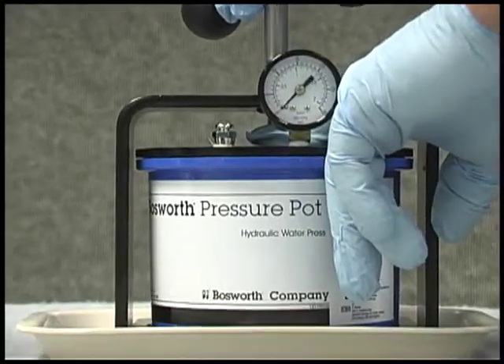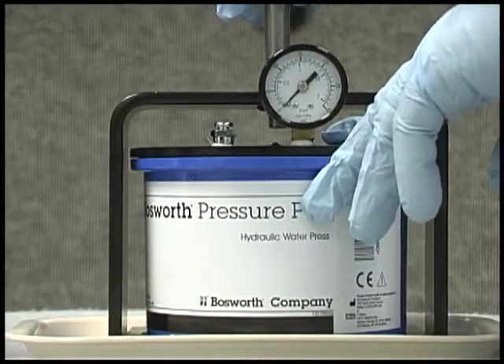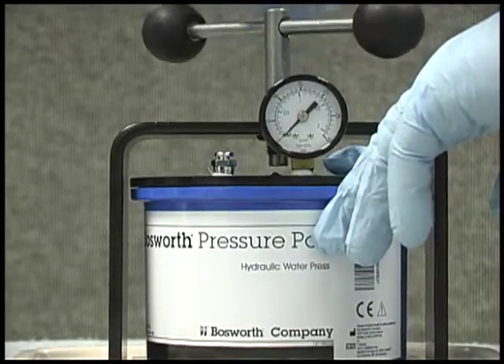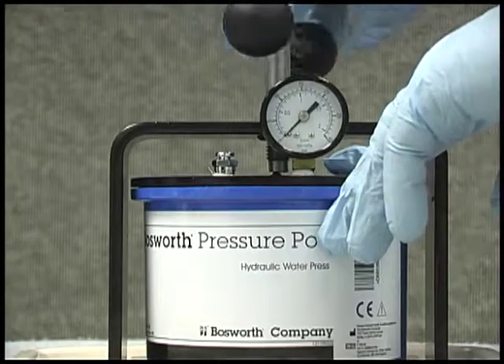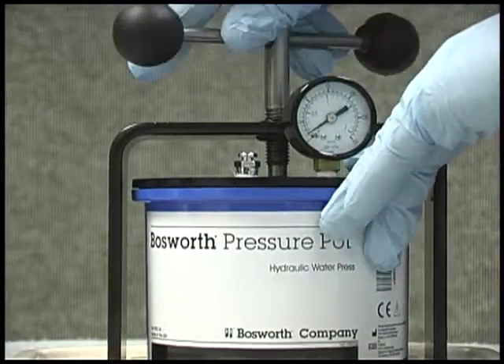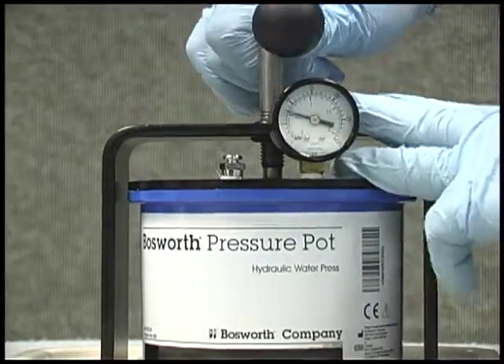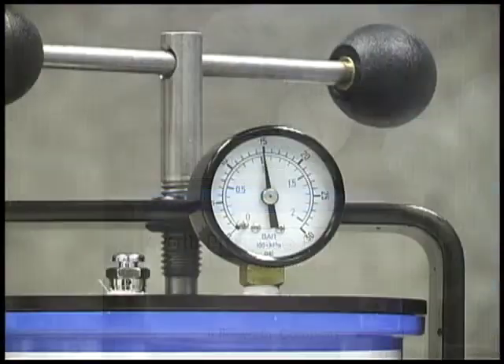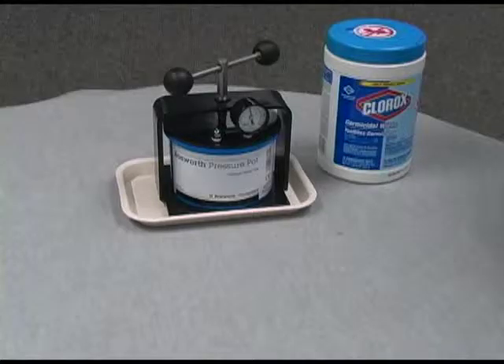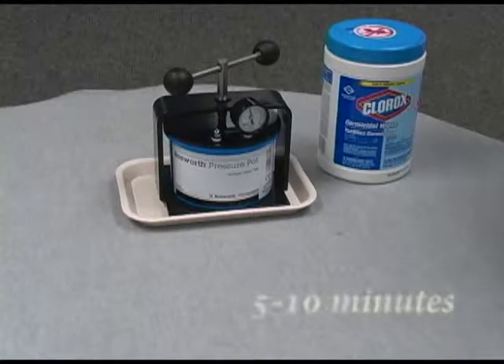Make sure to align the handle with the center silver button on the top of the pressure pot lid. For optimal results, turn the handle until the pressure pot gauge reads 10 to 15 pounds. To prevent damage to the pot, do not exceed 15 PSI, as this will strip the bushing off the brace or otherwise damage your pressure pot. Keep your acrylic appliance in the pressure pot for a minimum of 5 to 10 minutes.